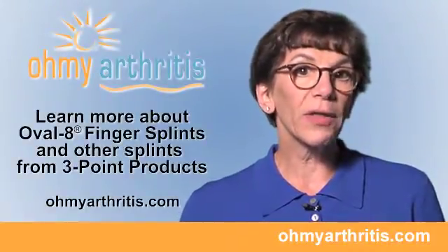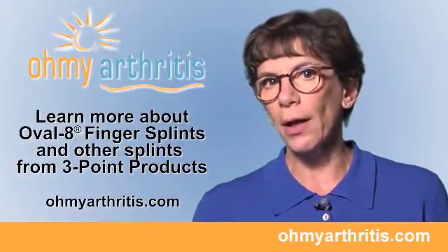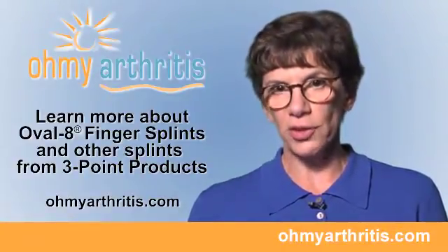Oval 8 splints are effective, easy to wear, and nearly invisible on your finger. Fitting an oval 8 can be done by your doctor or therapist, or by going to the website shown here and downloading the sizing guide and information on purchasing oval 8.